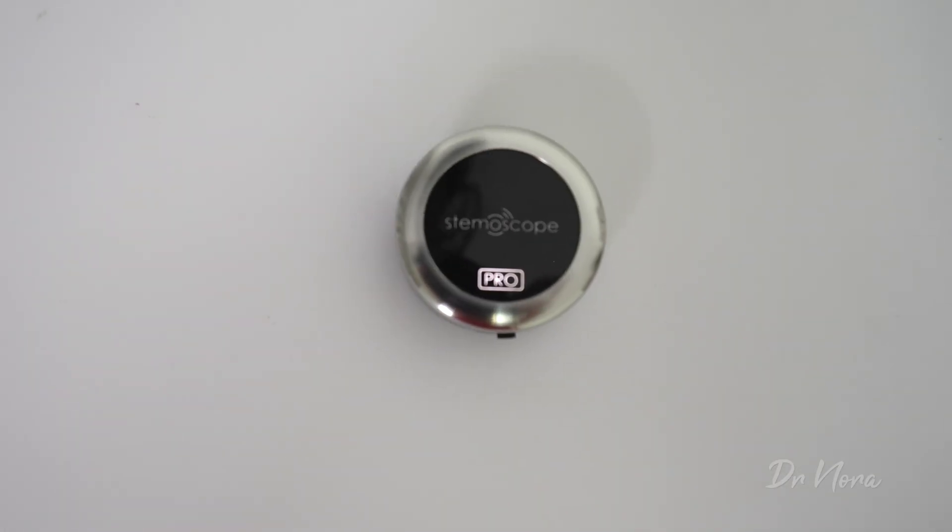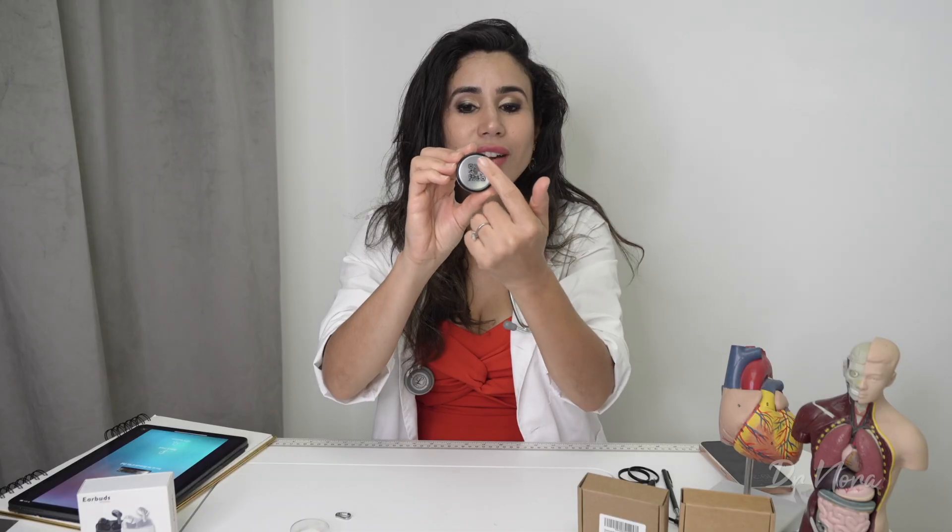Stemscope have upped their game and they've actually got this device now FDA approved, which means that healthcare professionals such as doctors, nurses, anaesthetists — anybody working in the hospital field — can actually use this for clinical practice. It is literally just a small listening device with a diaphragm on the back so you can have a listen to your patient's heartbeats.